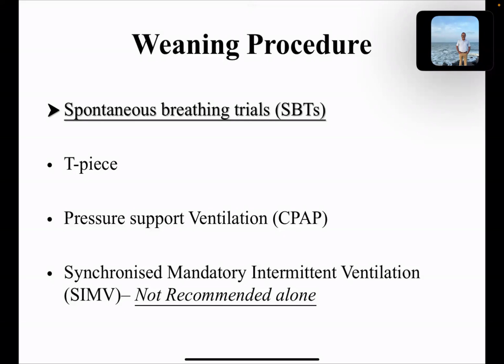Sometimes whatever the SIMV gives will be the patient's maximum. Then SIMV is not really working; basically pressure support ventilation is going on. That's why this is not an ideal method of weaning. In the majority of setups, SIMV mode is currently obsolete.